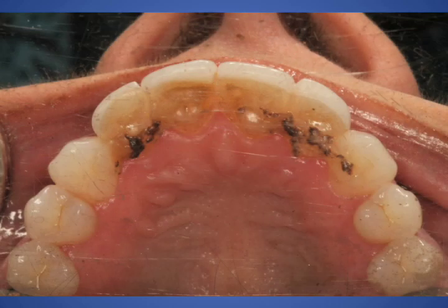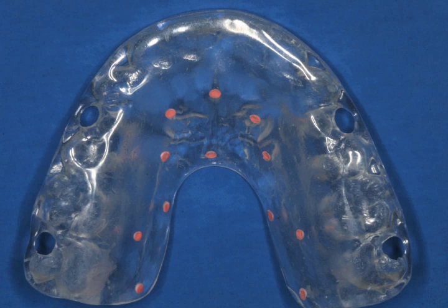So as she came in, she wanted to determine if we could immediately place implants and give her some immediate restoration of her maxillary 4 anterior teeth. So a CT scan was completed on this patient using a guide.